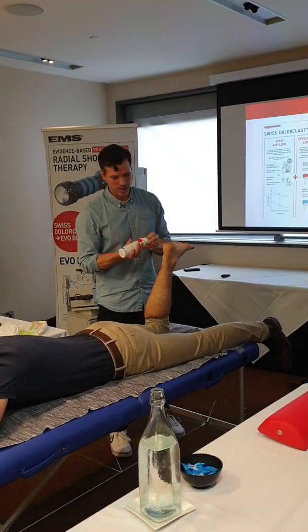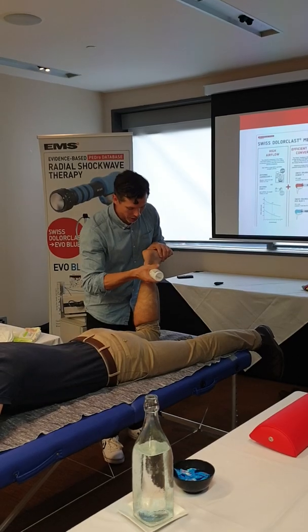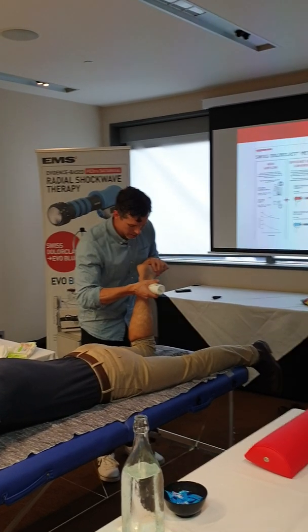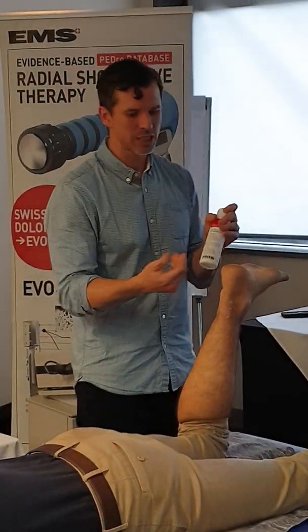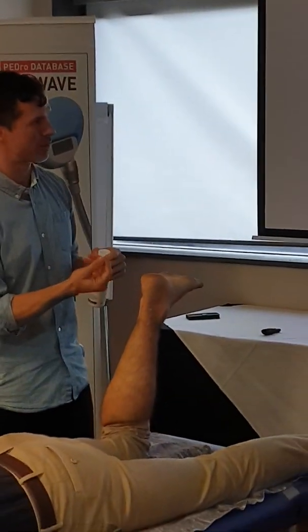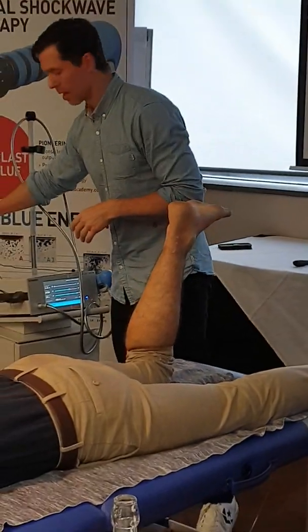So, I use the 15 mil. I put gel on both sides. So usually, where the problem tends to be, it tends to be more on the anterior aspect of the Achilles, yeah?